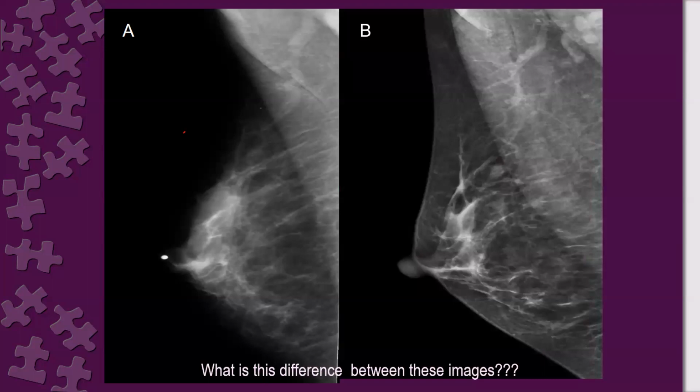This is the same patient, but a different technique. Can you see it now? Yes. It is upper outer. Yeah, it is prepectoral. It's prepectoral, there is a lesion here. But even in retrospect, it is difficult to visualize. If we trace these vessels, we can see some opacity here. We can imagine it might be.